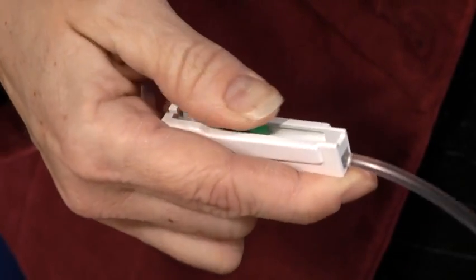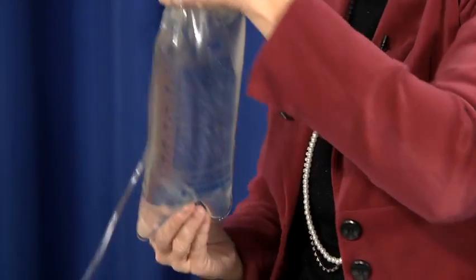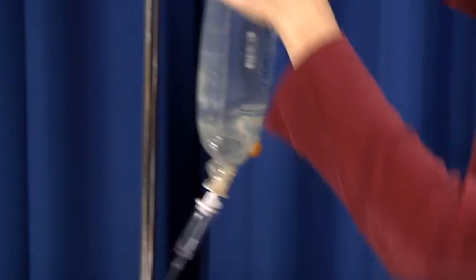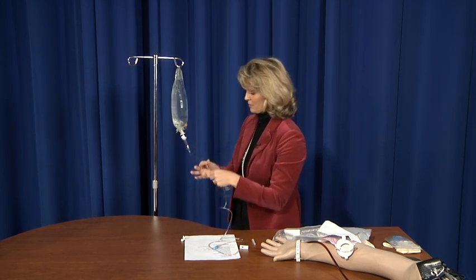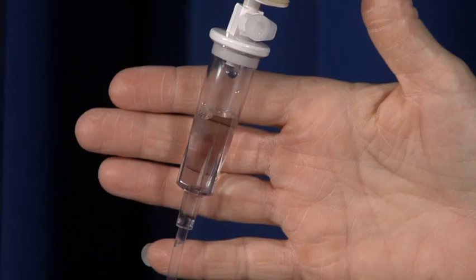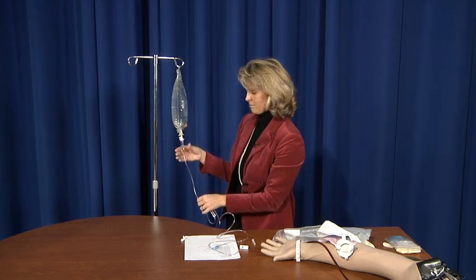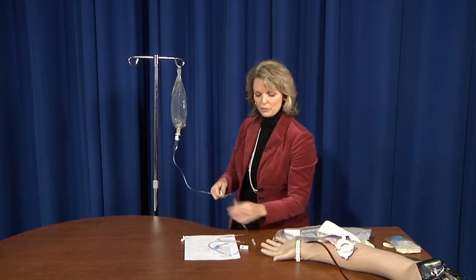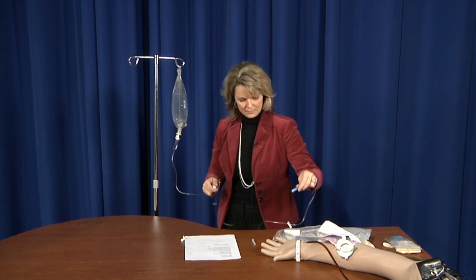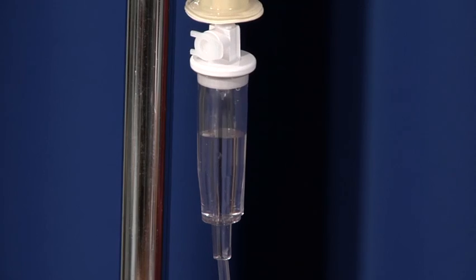Now we want to make sure we've got this closed before we flip this bag over. Otherwise we'll have water all over the floor. Flip your bag over, hang it up. No water, no normal saline, no solution in here. What we want to do first is squeeze this chamber. We're going to fill it about 1/3 to 1/2 full. So it may take 1 or 2 squeezes. After we've done that, we're going to undo our roller clamp. And you can see that it's dripping into the tubing.